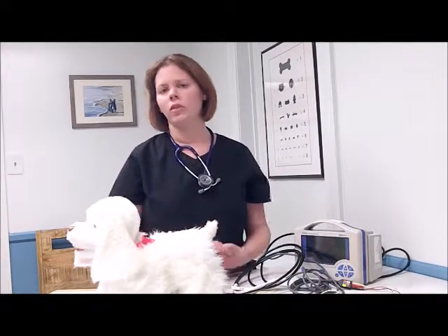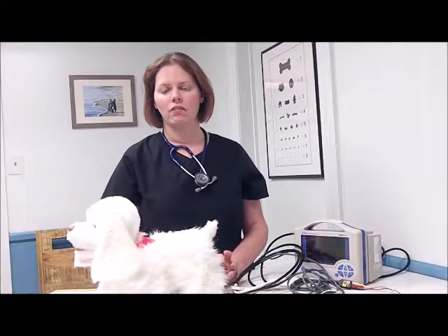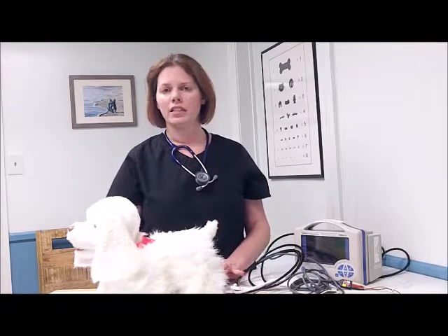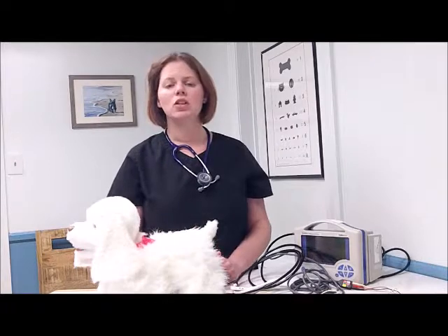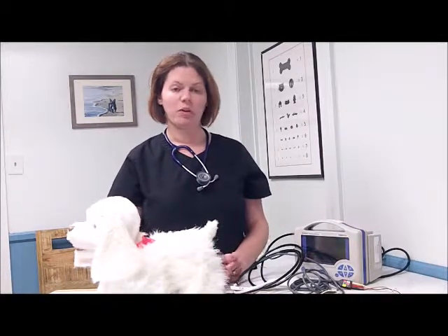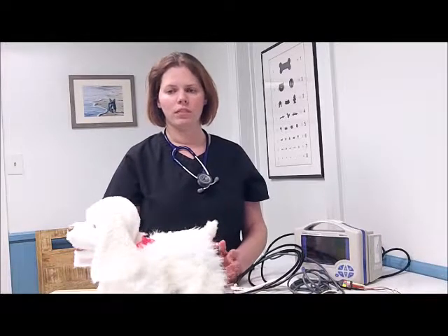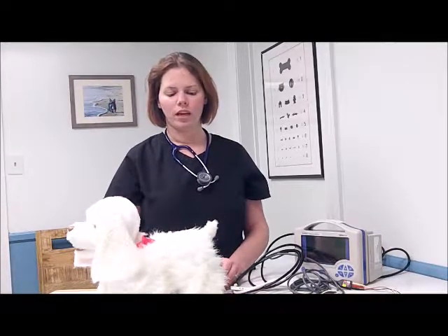We compensate for that with IV fluids, but it can also help us judge whether our planes of anesthesia are proper. If our patient's blood pressure is too high during a noxious stimulus, that is another indicator that our patient is responding to that painful stimulus, so we should increase our anesthetic depth. If our patient's blood pressure is too low, it could indicate that we are at too deep of an anesthetic level. We should decrease our anesthesia.